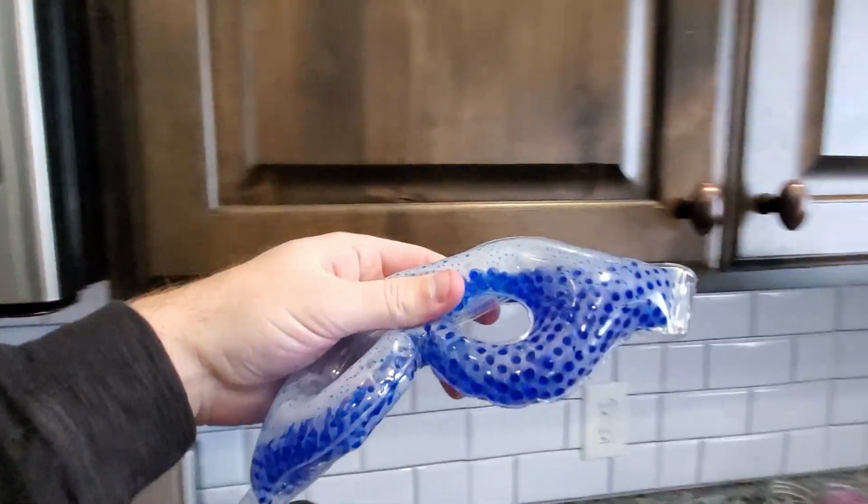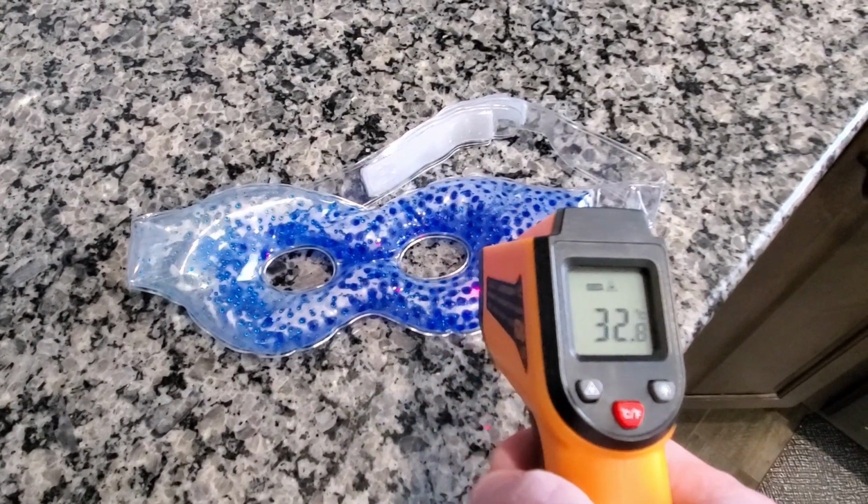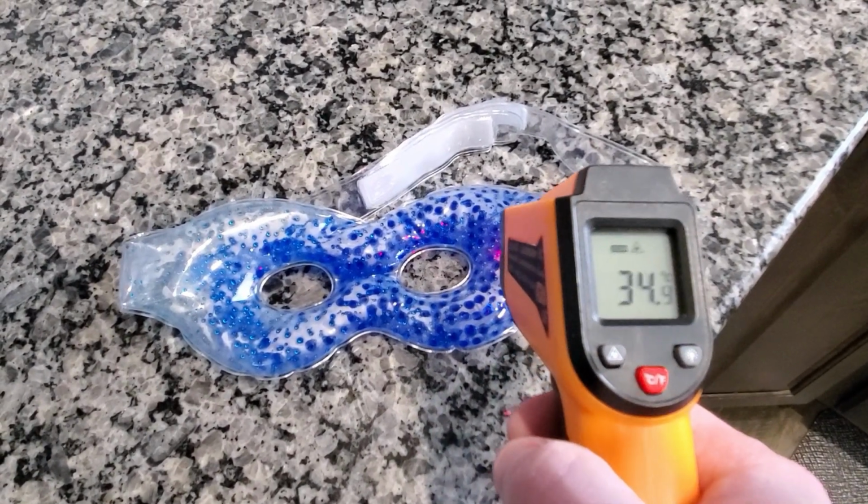Now, as promised, I did a little experiment to see how this compared to the TearRestore eye mask. This is a generic one that has the eye hole cutouts as well. It's $5 off of Amazon. I tried to see how it compared. Now, yeah, it did not do well. First off, I did heat this up in the microwave, and it does get to that optimal temperature range. The downside, though, is after about 3 minutes, it drops below the 40 degrees Celsius mark. At 6 minutes is about 33 degrees. So the temperature really drops off really fast. And so there's no way you're going to get to that 10-minute mark, let alone 15 minutes if you really wanted the best effective treatment.